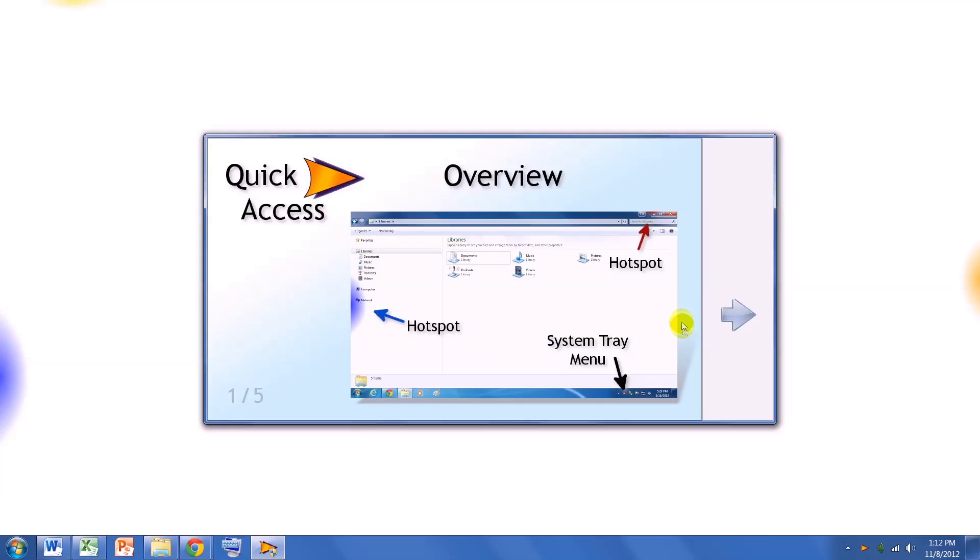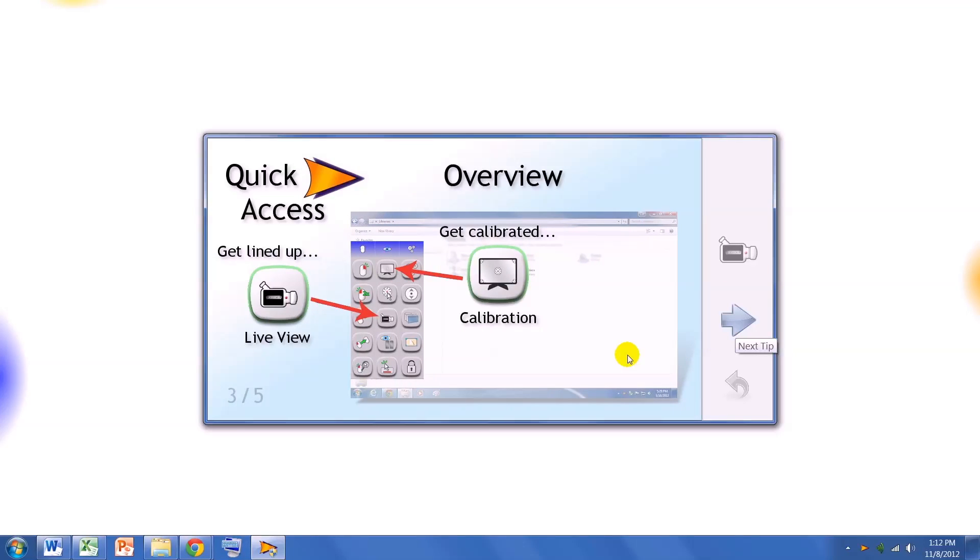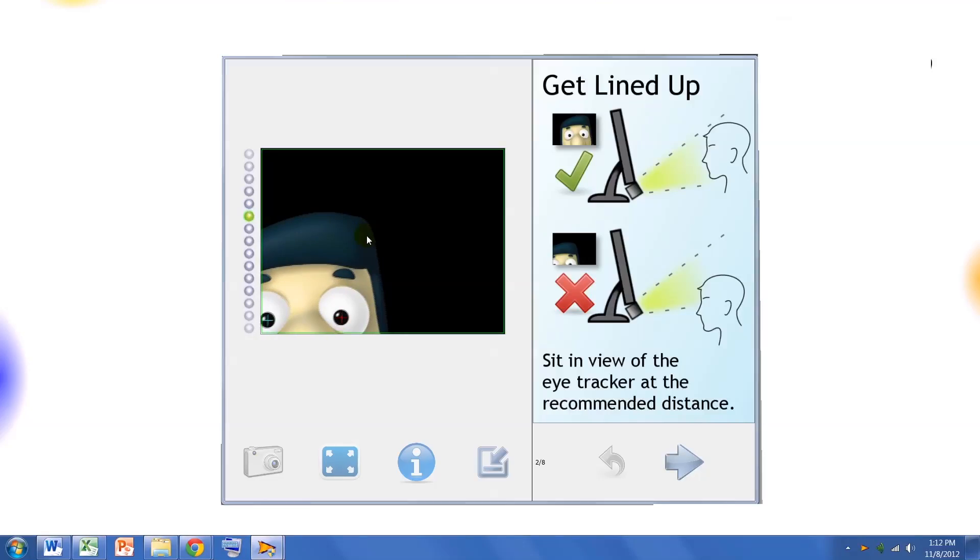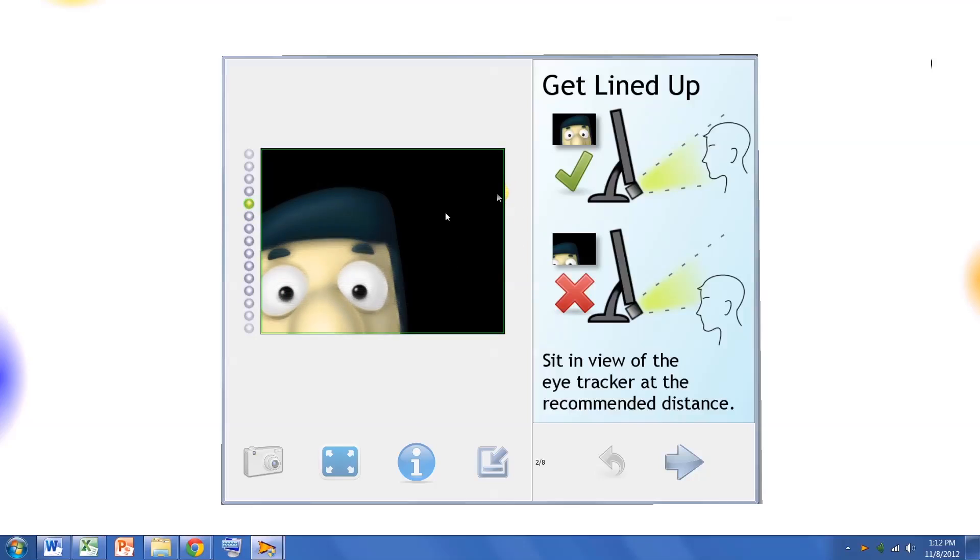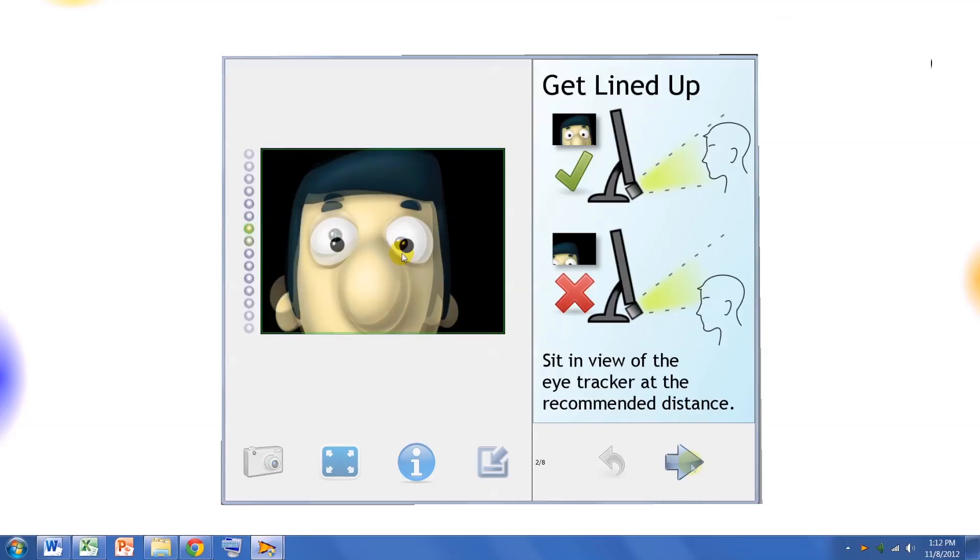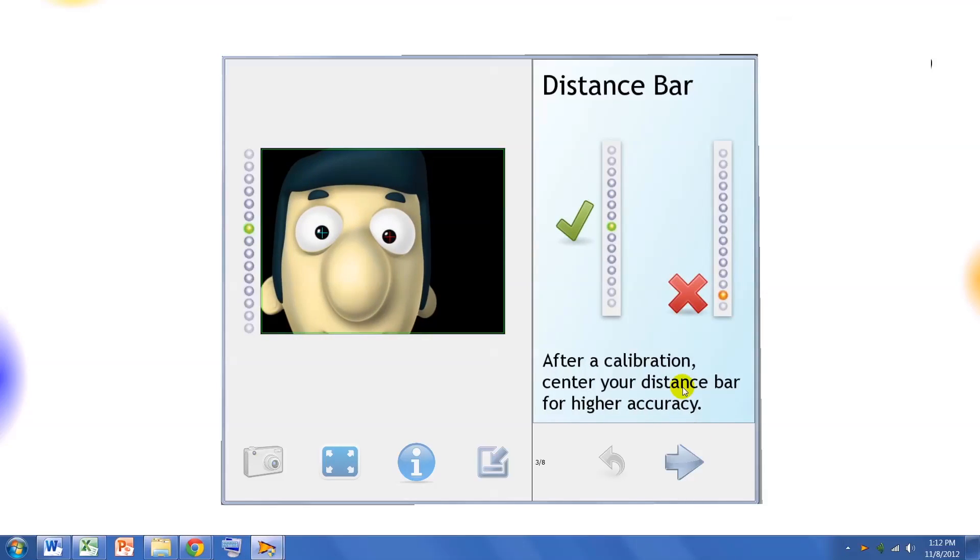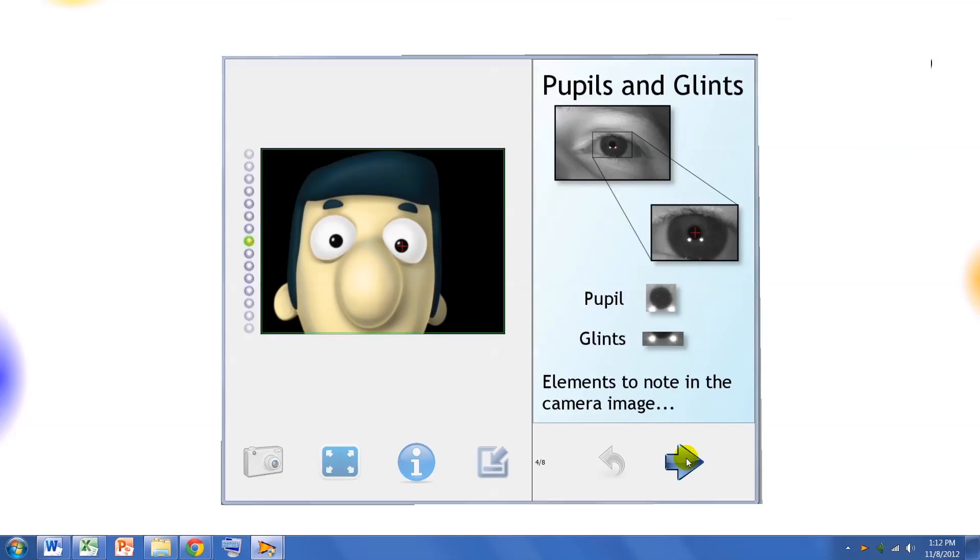When you first launch Quick Access, a few tips appear to help explain the new Hotspot technology user interface. Then, click on the Live View icon to get positioned and ready to calibrate. Our new Live View shows an avatar to help position the user. There are also new helpful positioning tips to the right. Click on the blue arrow to scroll through the tips to get lined up.